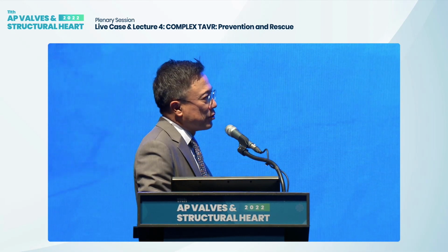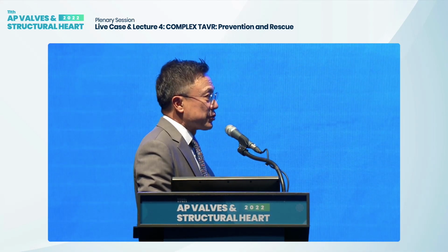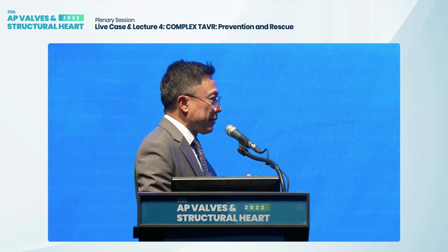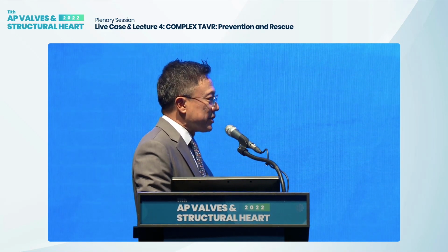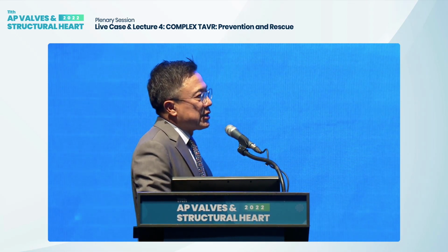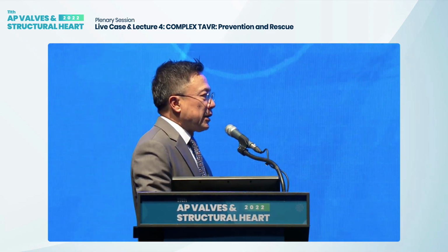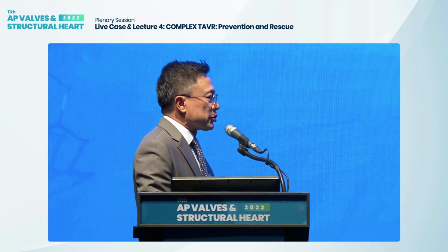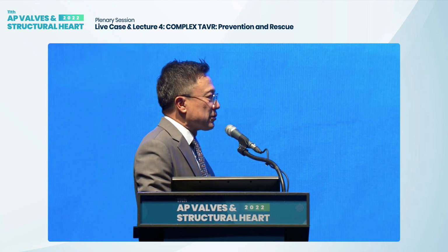So I still think maybe some sort of a balloon that is better in terms of anchoring, because as you know, with balloon valvuloplasty, a lot of times if you don't pace fast enough, in the old days, the valve squished back and forth and you never got a good dilatation. So a cutting balloon type or something like the True balloon or a shockwave balloon may be of help, but I would say the value is not great.